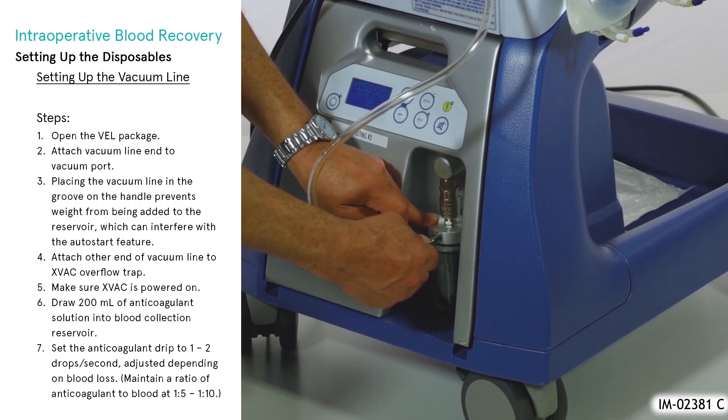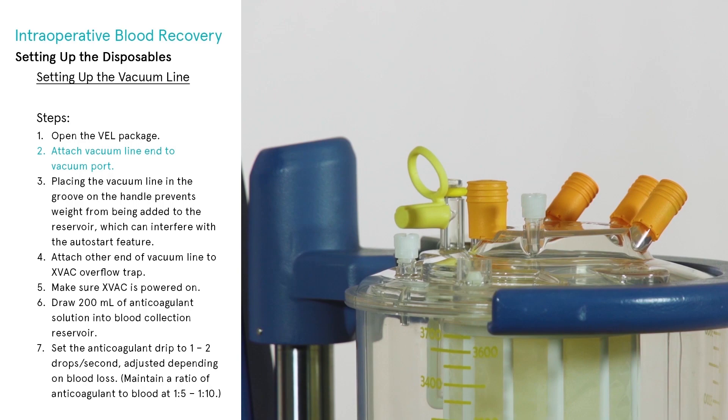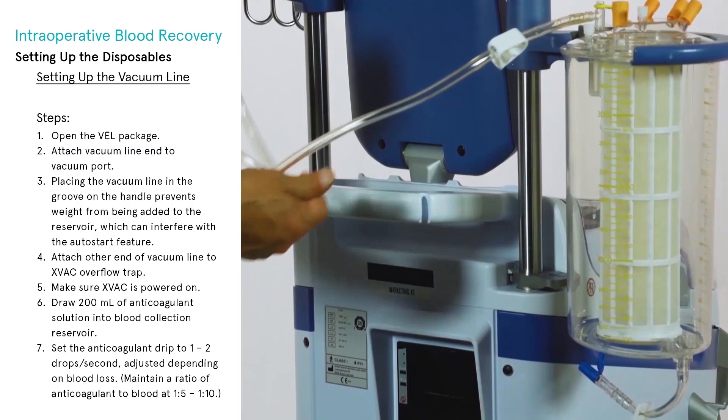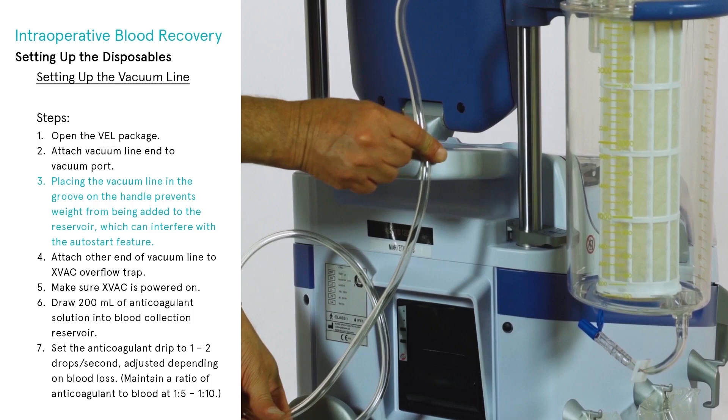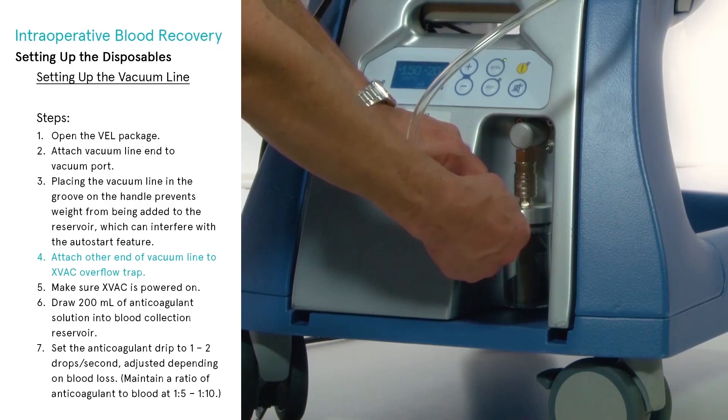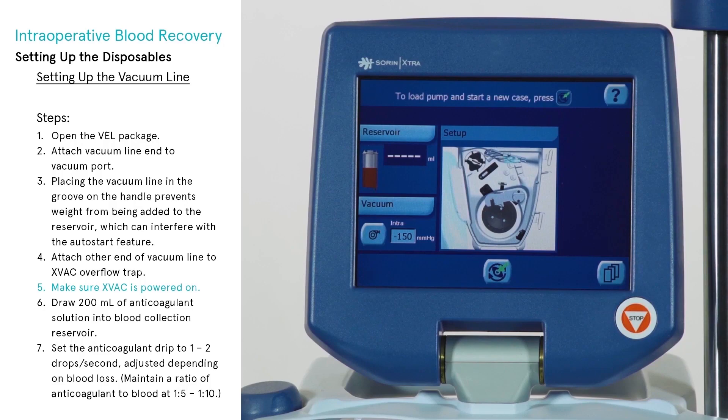To set up the vacuum line, open the VEL package. Using aseptic technique, attach one of the yellow capped ends of the vacuum line to the yellow capped vacuum port on the top of the reservoir. Placing the vacuum line in the groove on the handle prevents weight from being added to the reservoir, which can interfere with the auto-start feature. Attach the other end of the line to the overflow trap of the X-VAC system, and ensure the overflow trap is clean and dry.